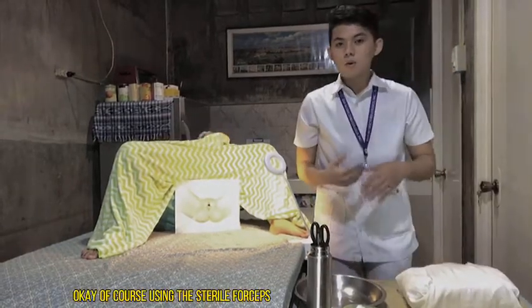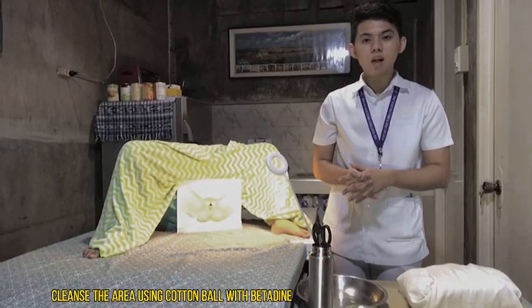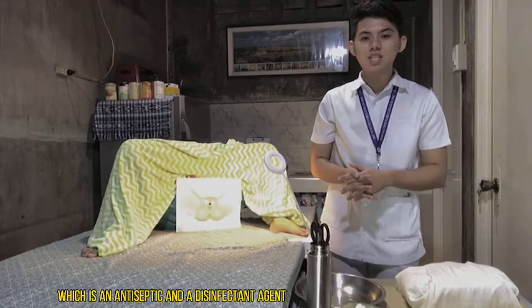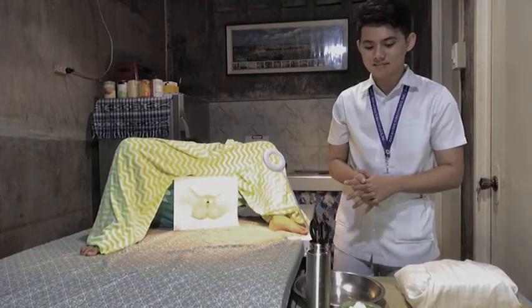Of course, using the sterile forceps, cleanse the area using cotton ball with betadine, which is an antiseptic and a disinfectant agent to prevent and treat possible infections in the vagina.